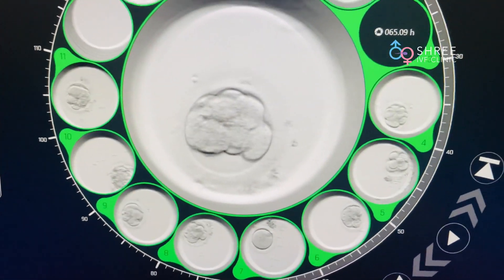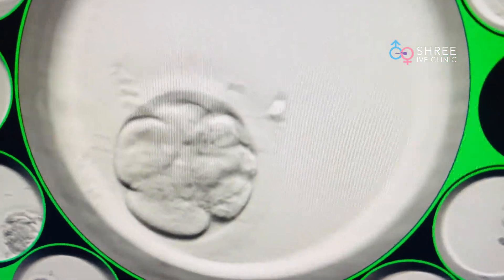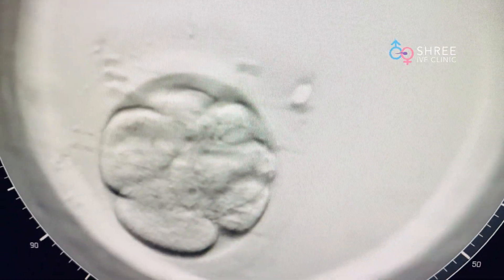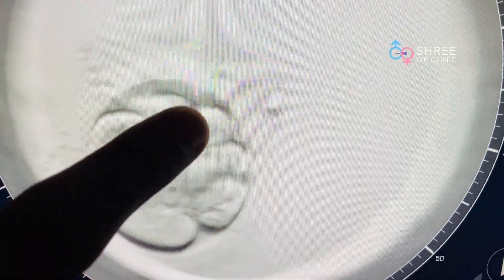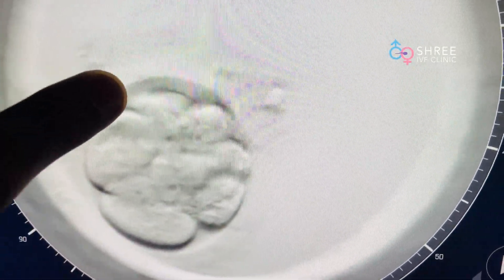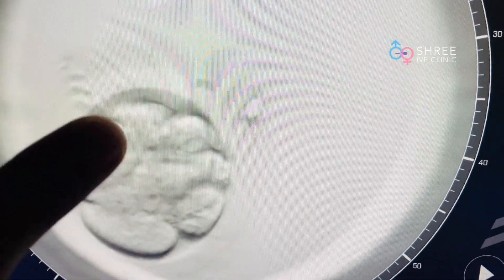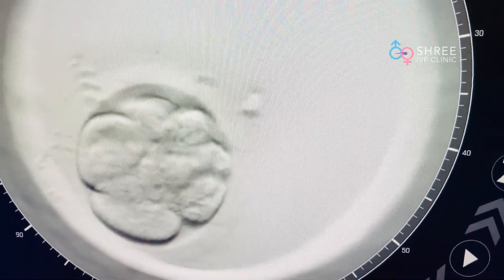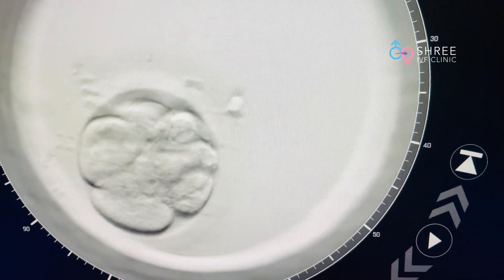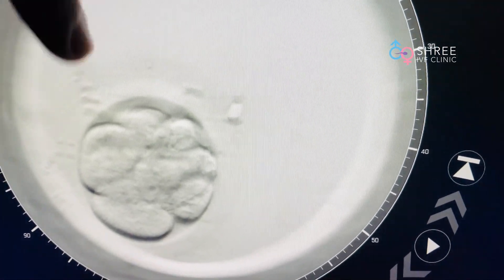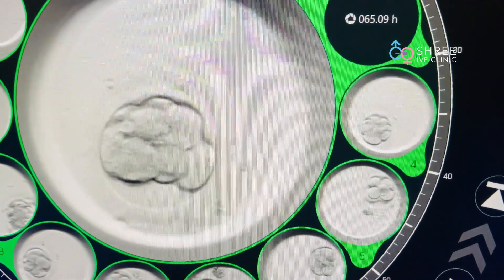Let's look at the other embryos of the same patient. This is another embryo of the same patient. You can count the number of cells: 1, 2, 3, 4, 5, and then there is one behind — the sixth one. But if you just visually see this, even as an innocent observer, you will realize that this embryo is not looking as good as the previous one.